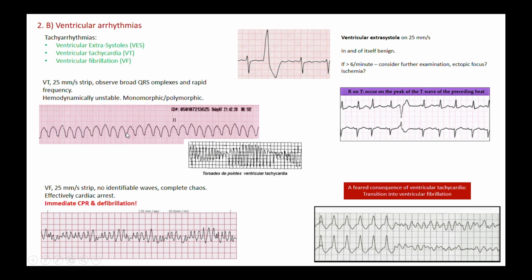Now this R on T, which we just mentioned, in a ventricular extra-systole, increases the risk of such a ventricular tachycardia occurring. Ventricular tachycardias, these patients can be in different stages of hemodynamic or circulatory instability. Some patients I've seen with ventricular tachycardia when I was working in the emergency room in Ålesund Hospital, some of them would be completely conscious, of course feeling their heart racing and feeling the palpitations, uncomfortable because of it, but conscious and responding to questions.